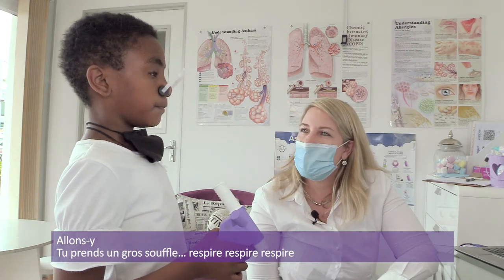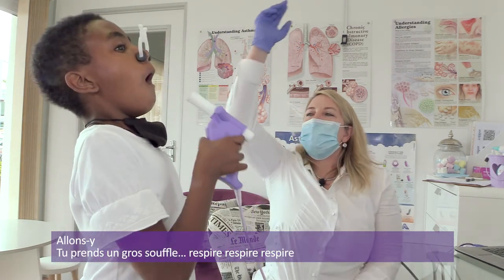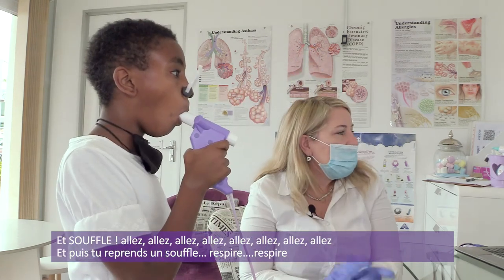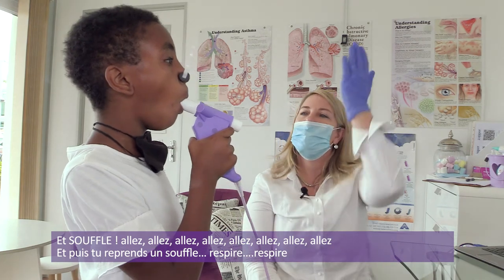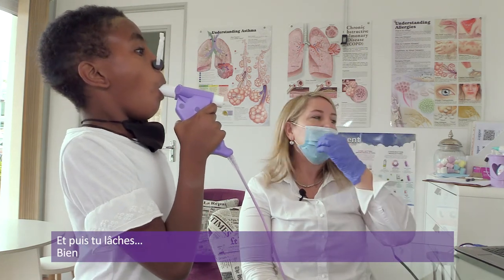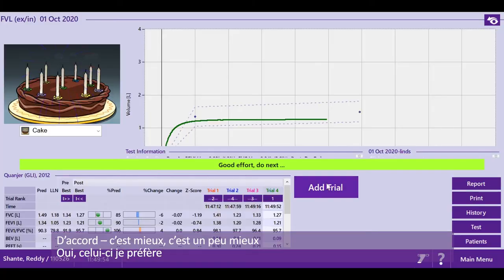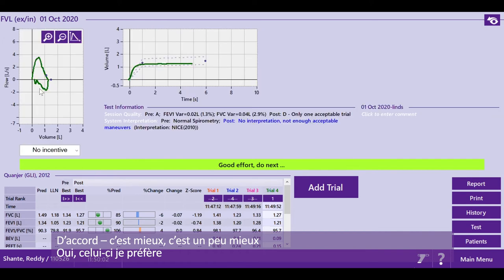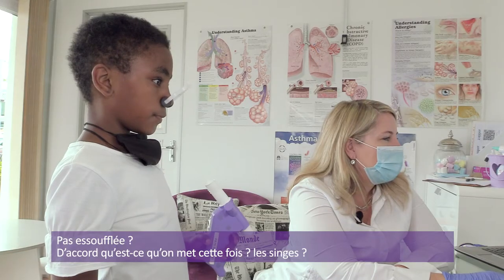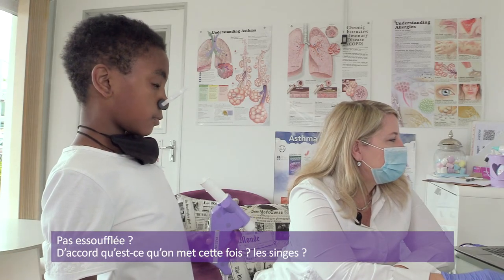Okay, let's give it a try. Okay, big breath in. Fast as you can. Go. Breathe in. And rest. Good. Okay, that one was better. Okay, that one was a little better, definitely. Yeah, that one I'm happier with. All right, do you need a rest? You feeling okay? Not short of breath?